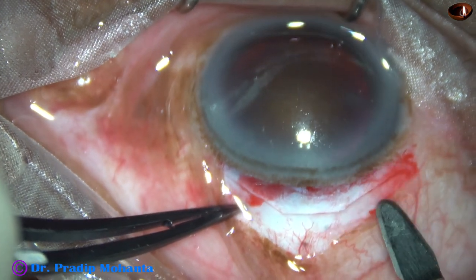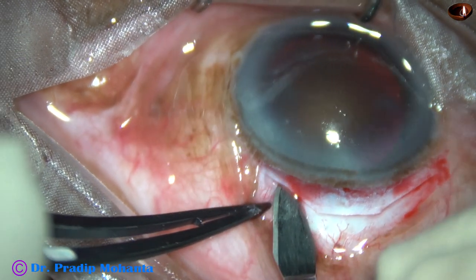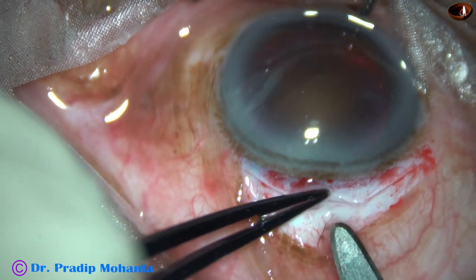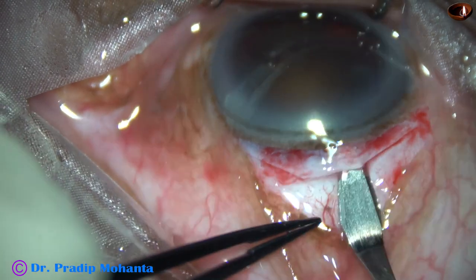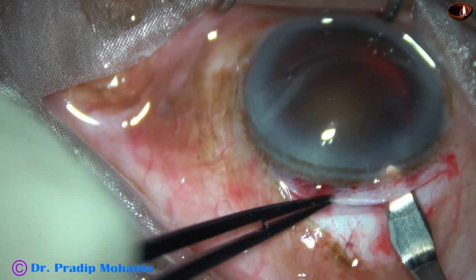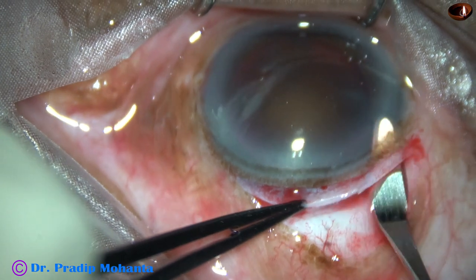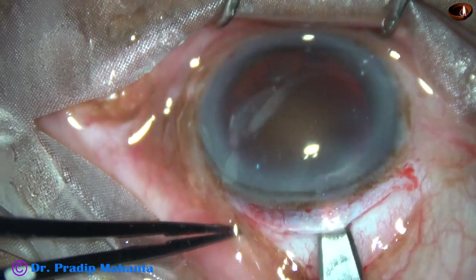If we do a tunnel, the number of sutures to be applied will be much less. But if we don't make any tunnel, we have to put many sutures. Even a shoelace suture may be necessary and the wound is much weaker — mild trauma can open the wound. But this sclerocorneal tunnel is much more resistant; mild trauma will not cause opening of this wound. So this is a nice sclerocorneal tunnel.